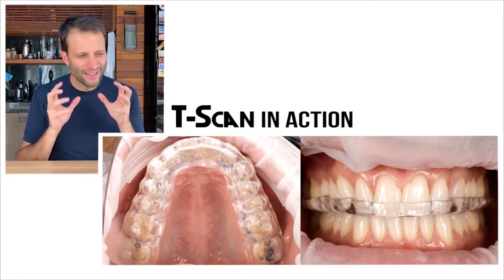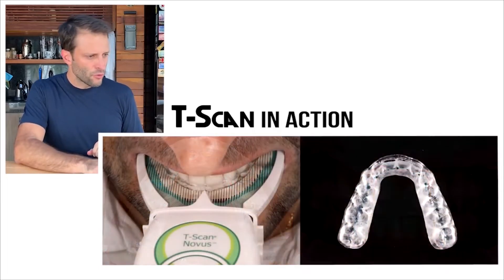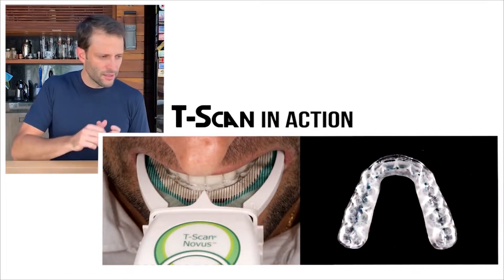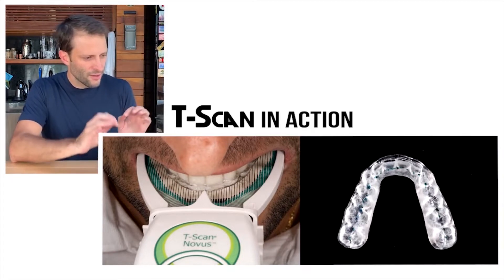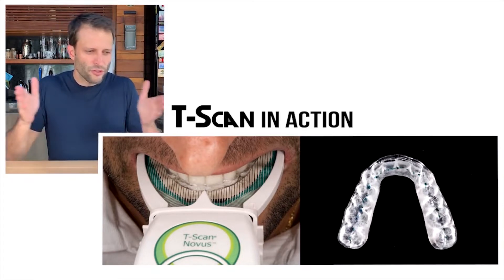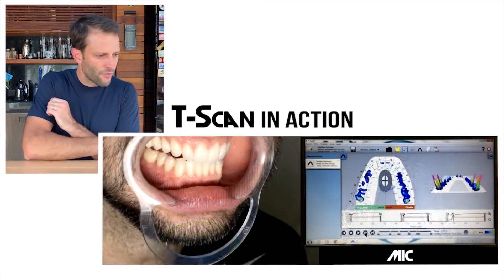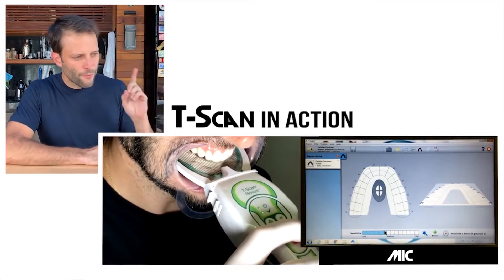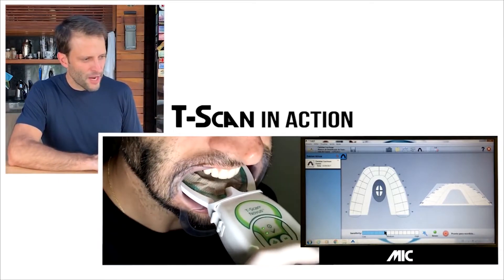When we touch all the teeth together, we can see that the bite is where it should be. What I'm doing here is a selfie T-scan — it's so simple to use that we can even do it on yourself. Of course, on regular patients, the dentist is usually doing that. There are a couple of videos of myself; first I'm testing maximum intercuspation.